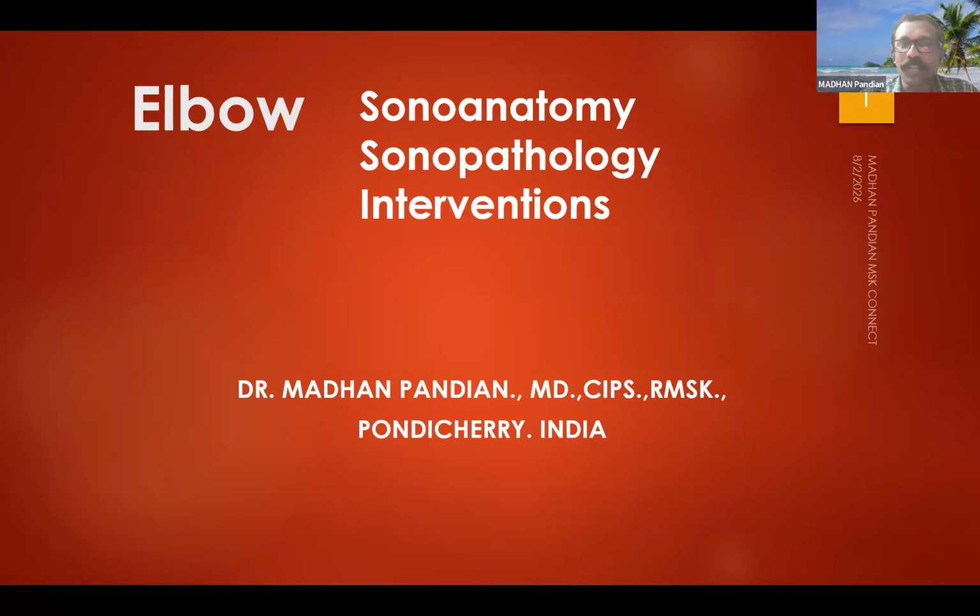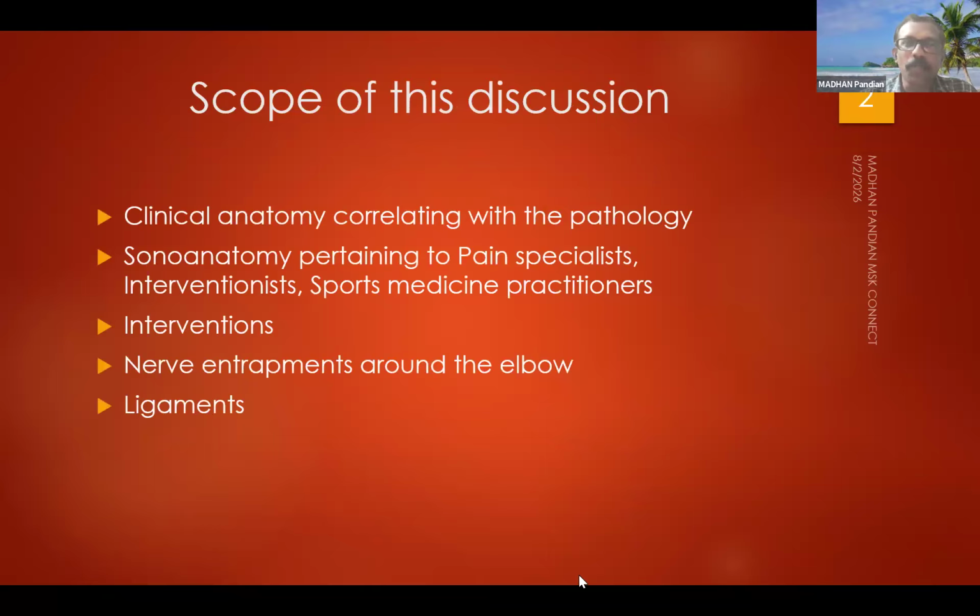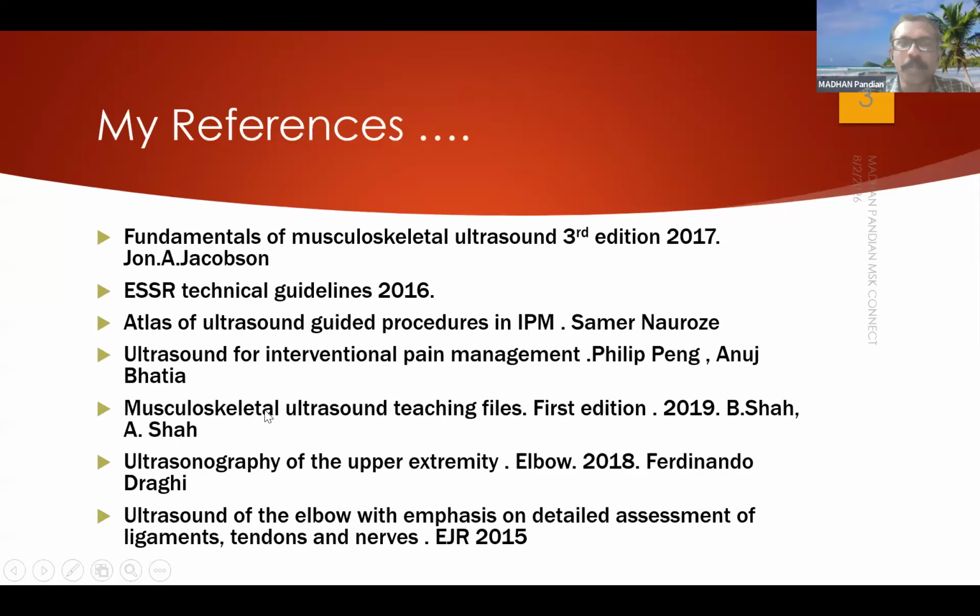We'll discuss the sonoanatomy, the pathology, and the interventions associated with the elbow. The scope of the discussion will be the anatomy and sonoanatomy which is pertinent to pain specialists, interventionists, and sports medicine practitioners: nerve entrapments and the ligaments around the elbow.